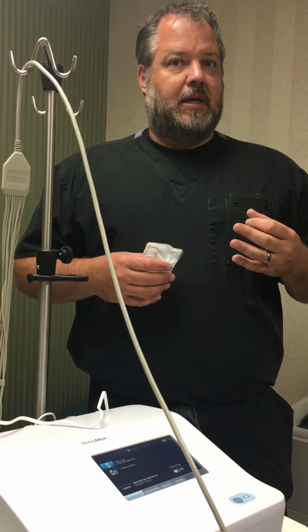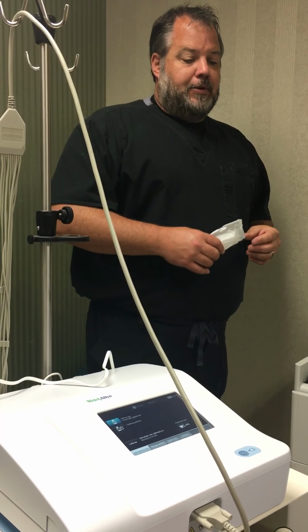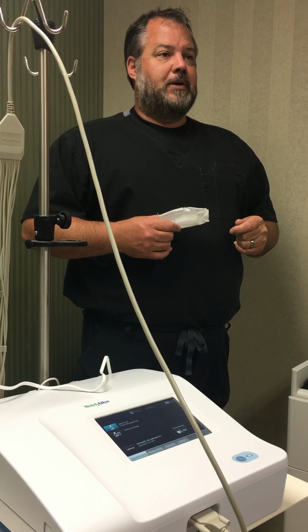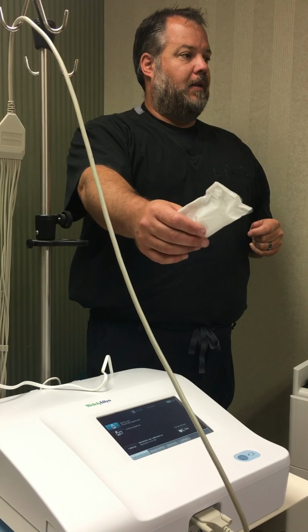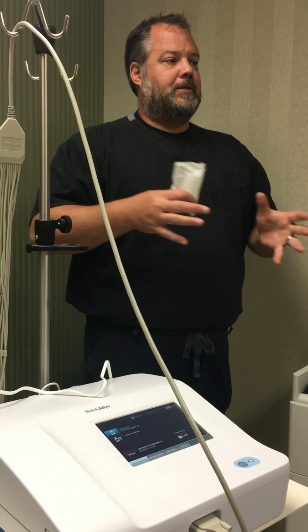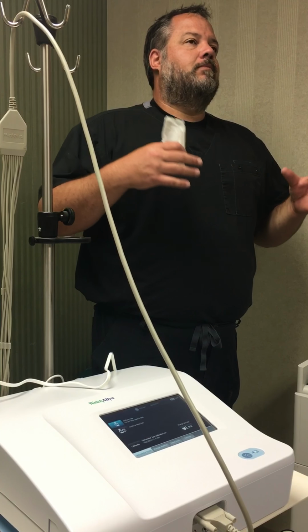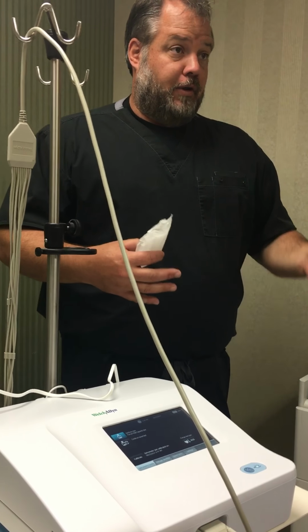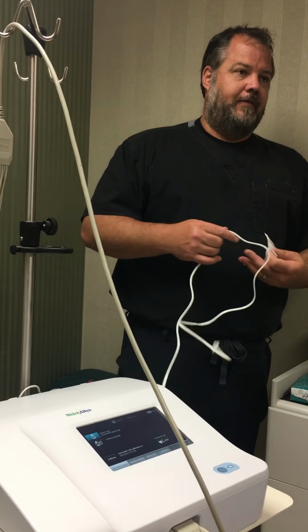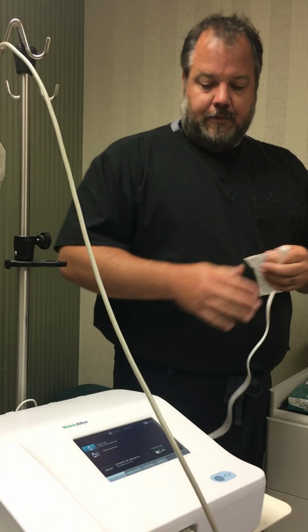I can't tell you how many times I've gone into an account like this, and I'll teach them spirometry, and then they go to a patient, okay, today we're gonna do spirometry. I need you to blow as hard, as fast, as long as you can, and they hand it to them. If I say that to everybody here, everybody's interpretation is different. If you show them, it'll go a lot quicker for you and for them. The next time they come in, they'll already have the hang of it. So if you've got an asthmatic, whoever you're treating, then it'll be easier.